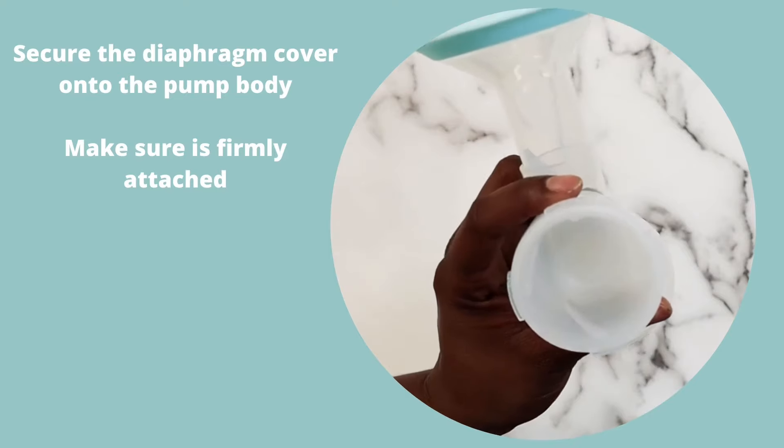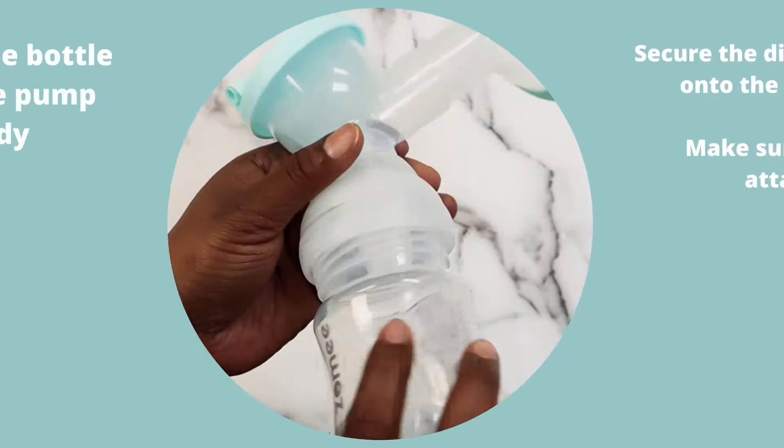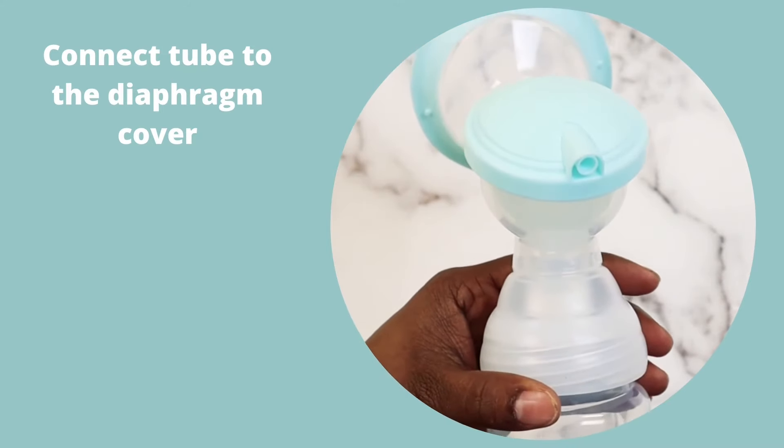Secure the diaphragm cover onto the pump body. Screw the bottle into the pump body. Connect the tube to the diaphragm cover.